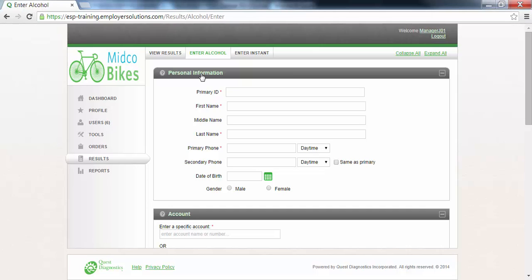The personal information section contains a list of all of the required and optional donor identifying fields. Each required field is identified by a red asterisk. The tab key can be used to move from one field to the next.